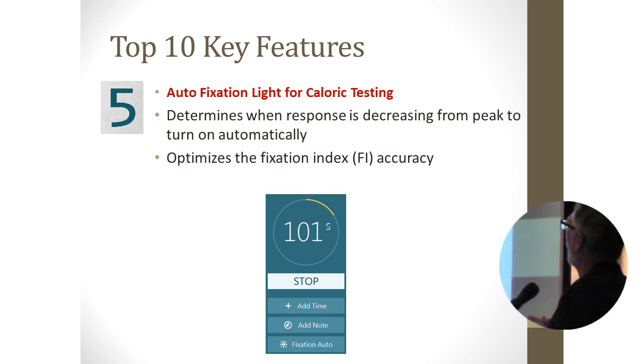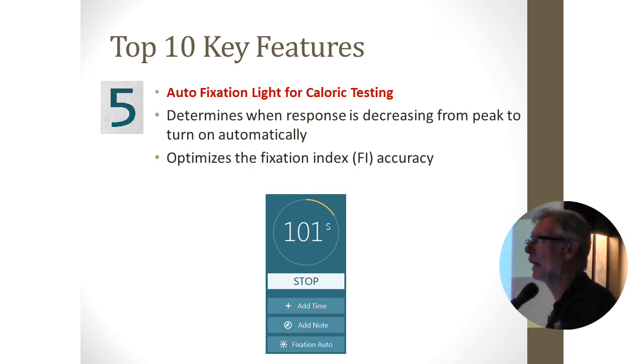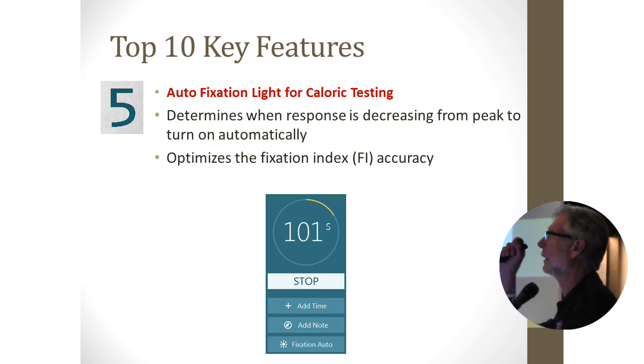Another thing is autofixation. Sometimes the only time you're able to test visual fixation suppression is during the calorics. All of a sudden you're able to say to the patient, okay, I'm going to put a red light on inside of the goggles, I want you to look at that. And then watch their nystagmus decrease.